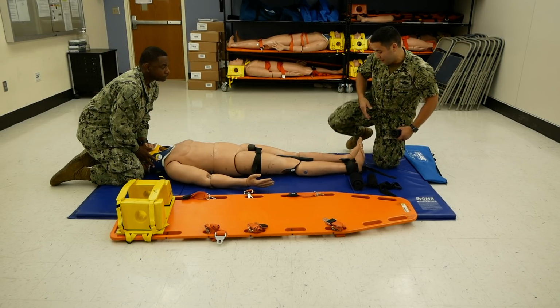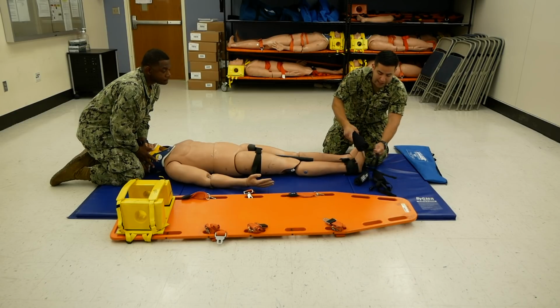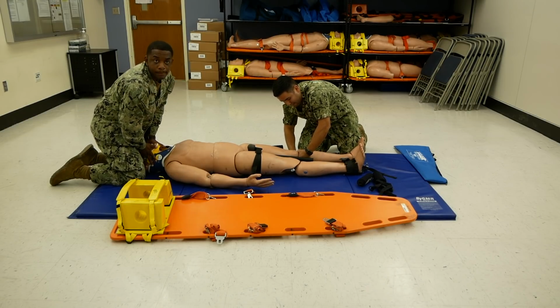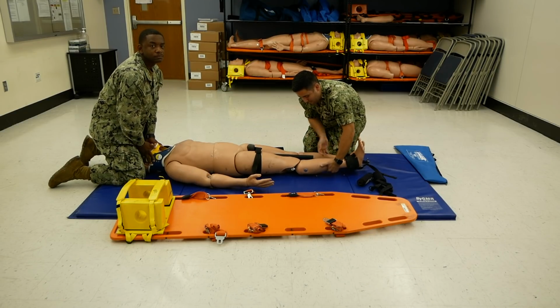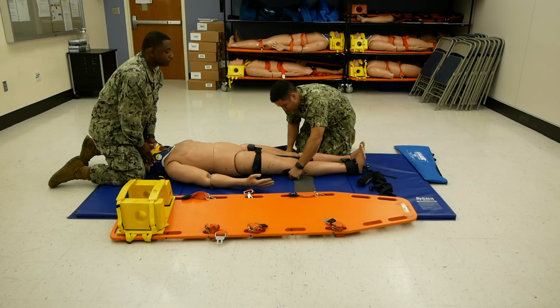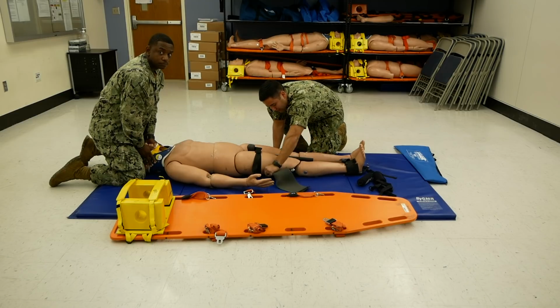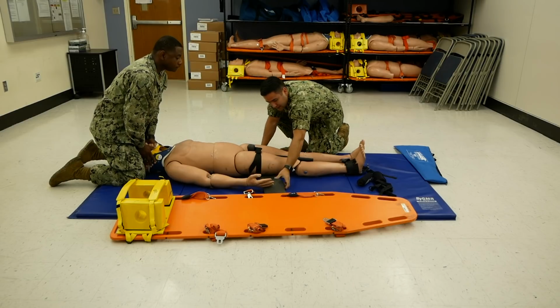Now that the traction splint is applying the appropriate traction, go ahead and apply the cravats. Your other assistant can help you raise the legs because the plastic on the mannequin sometimes tends to tear up the cravats itself.